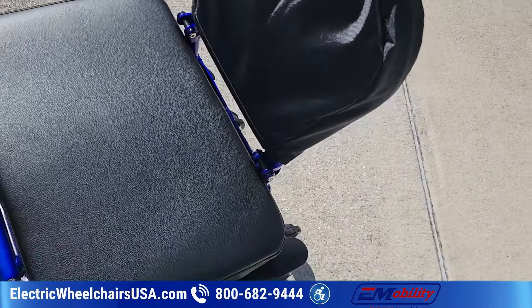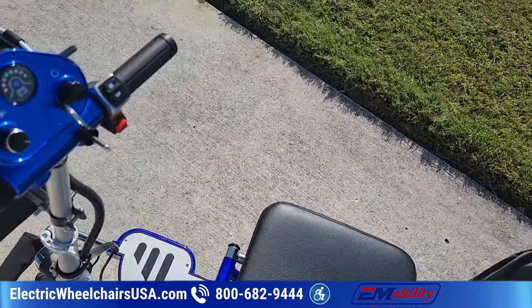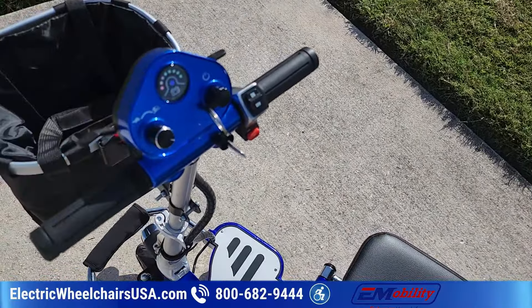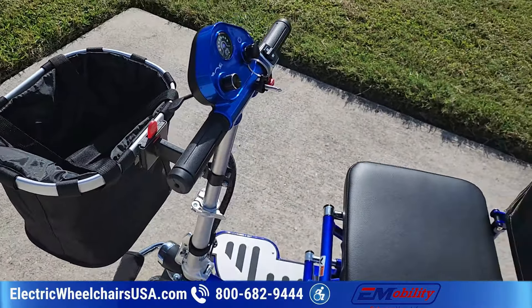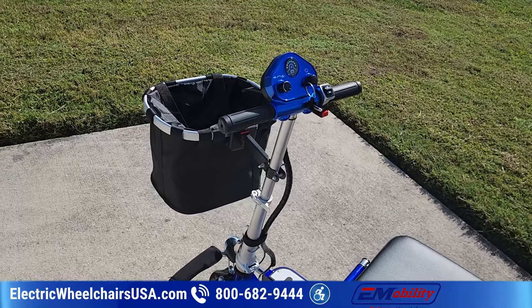It comes standard with an 18-inch wide seat that does not have armrests — something to keep in mind if you want armrests. The top speed on this scooter is six miles per hour. The Triax Sport is more of a recreational scooter, so the top speed on that one is 12 miles per hour.